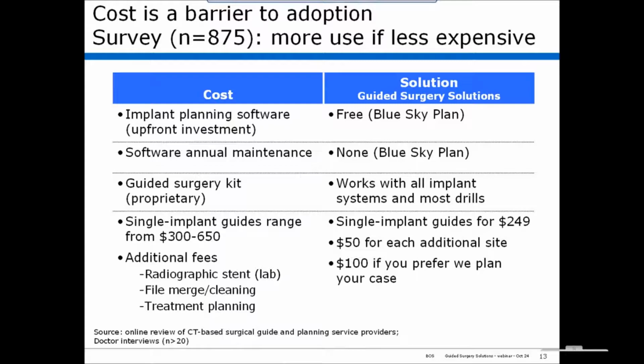Do you want to elaborate on which situations the dentist has to be concerned about the scatter and the problematic merges? Sure. That would be if there's a lot of crowns in the patient's mouth, or if there's a crown near the surgical site of interest. That could be a problem. And again, we could spend an hour talking about just scanning, because there are things that you have to be aware of when you scan these patients to minimize problems, such as separating the teeth, trying to scan one arch, things like that. Or if you have the option of removing a bridge and placing a temporary to get rid of the metal, that's often helpful. And all these protocols are available on your website? All the protocols I'm describing are on our website.